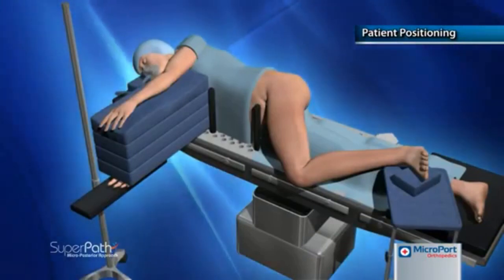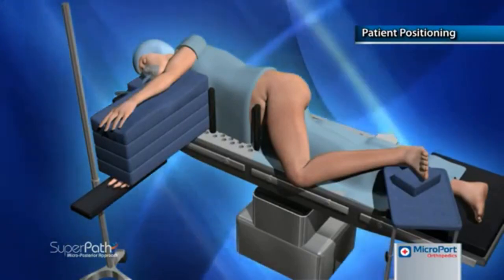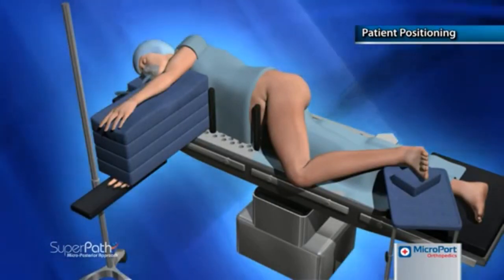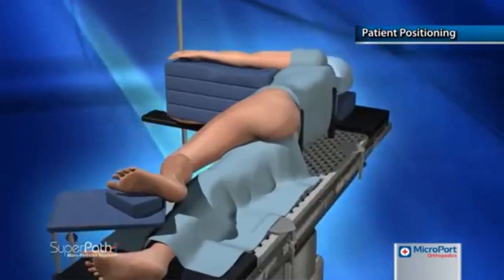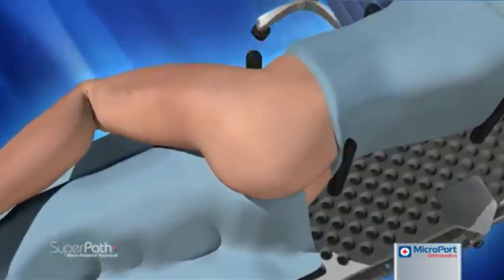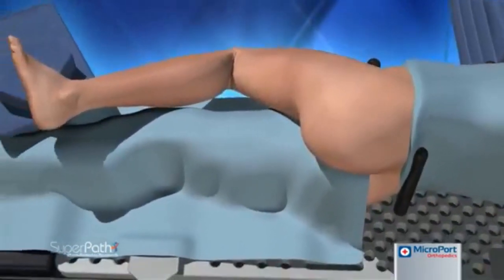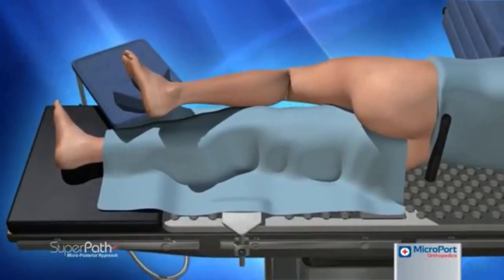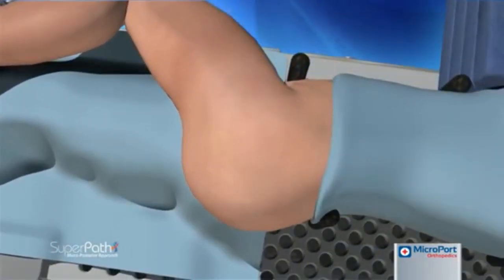The patient is secured in a lateral decubitus position on the operating table, preferably with the use of a pegboard and radiolucent pegs to permit a good quality intraoperative x-ray. With the pelvis leaning slightly posterior, flex the operative hip 45 degrees and internally rotate the operative leg 10 to 15 degrees to orient the greater trochanter upward. Resting the operative foot on a padded Mayo stand with the leg in slight adduction, the weight of the operative leg will bring the pelvis to balanced neutral rotation. This is the home position of the technique, as the operative leg will remain there for most of the procedure.